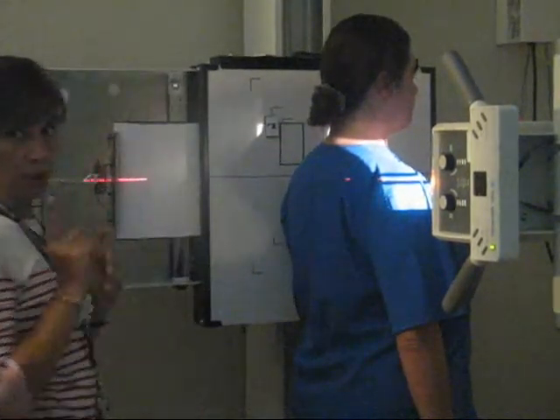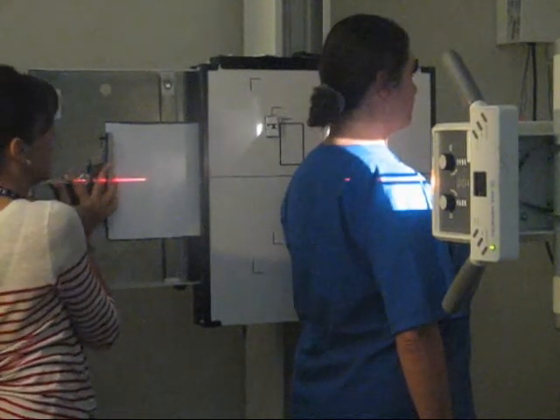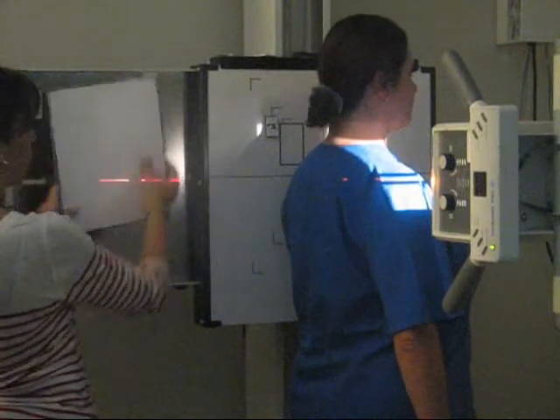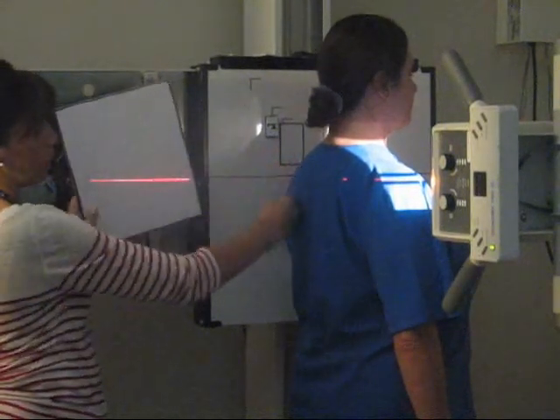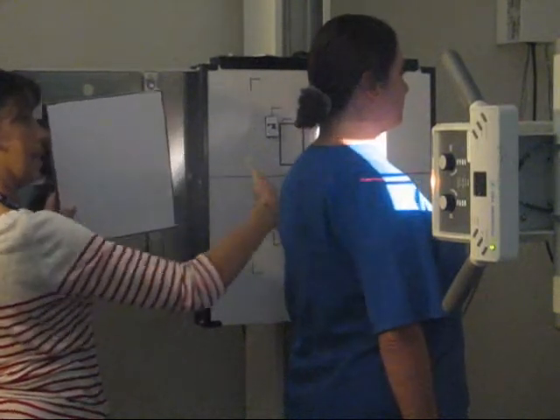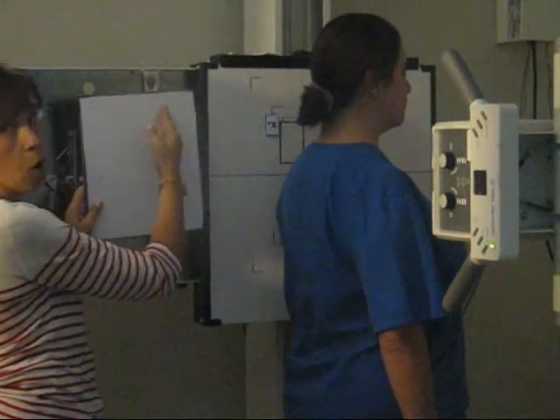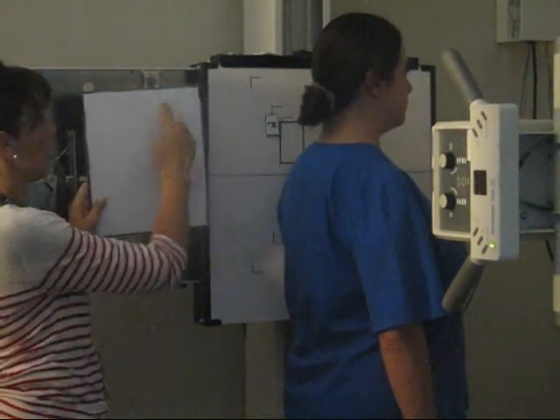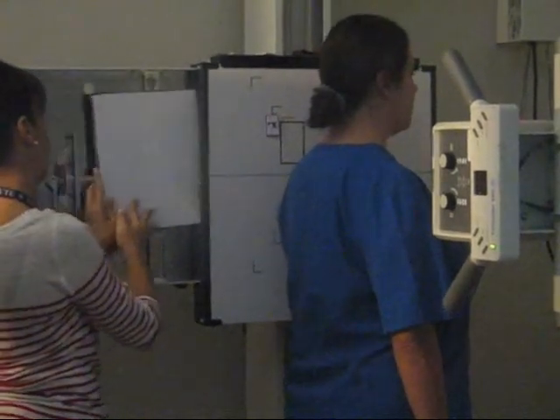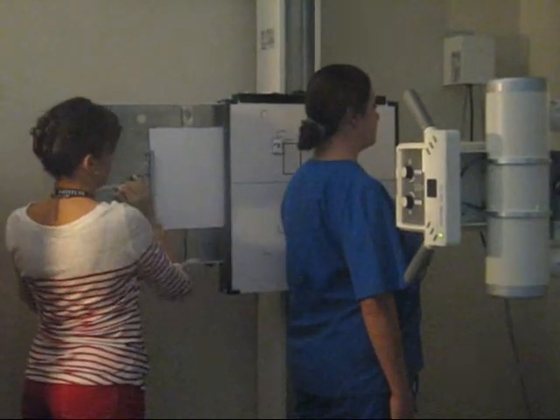For this projection, you may use the same 10 by 12 cassette, but in this case, I would not use it crosswise, I would use it lengthwise. The view that you're going to be seeing is a view in this way of the scapula, and it's going to show up almost as a Y, and so you know it's a lengthwise image, okay, which is why we call it the Y view. It's going to appear as a Y.